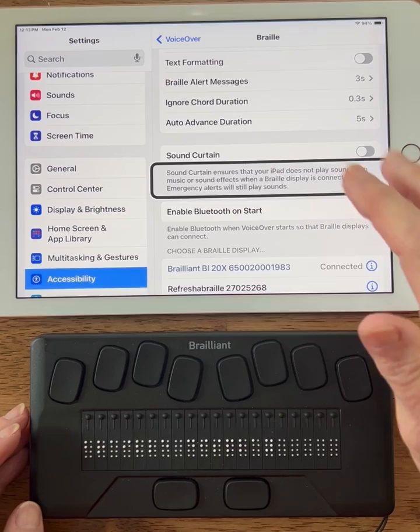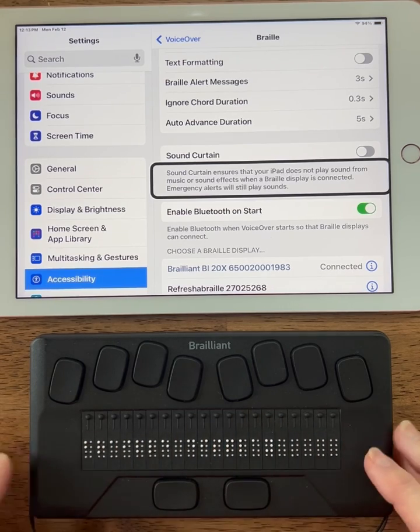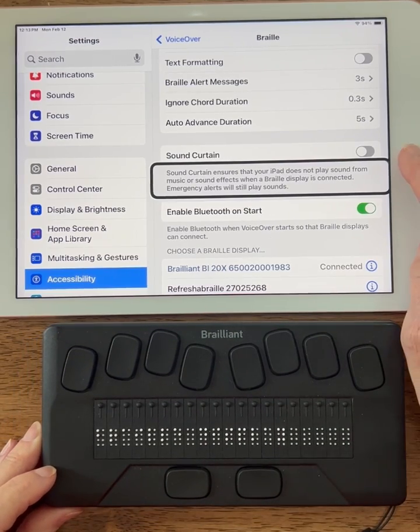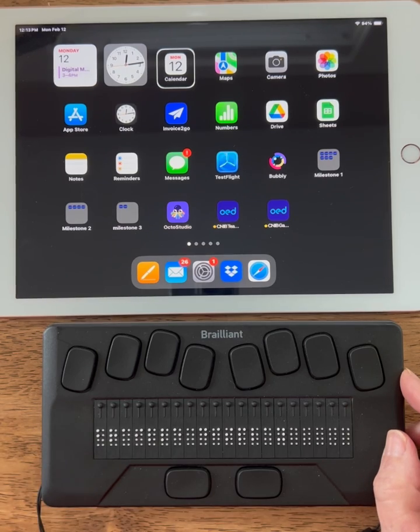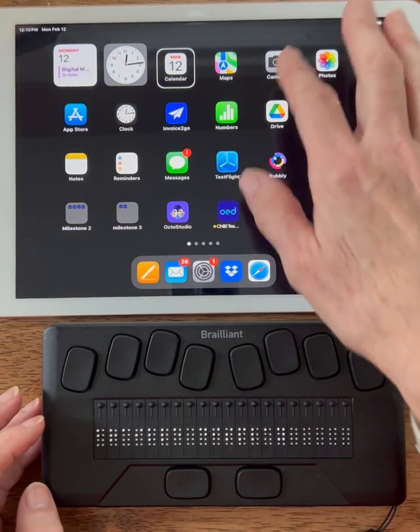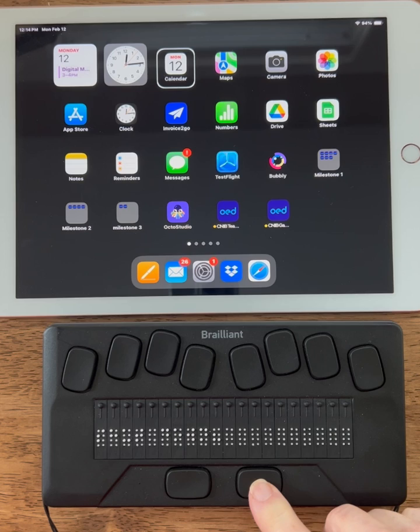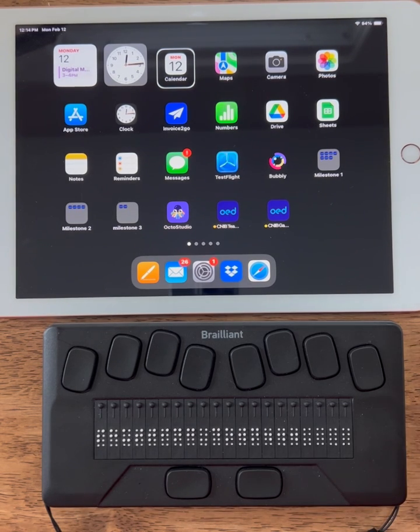I should be able to drag my finger around and the Braille should be mirrored on my Brailliant, but right now it is not. It still says 'Braille display.' Normally if I press my right panning key that will complete the pairing process, but this time it did not change — I've been having that issue where I can't use any of my chords like one-space or four-space to navigate the home screen. Nothing is working. The quick solution is to shut down the iPad. I'm going to use any routing button to select OK and shut it down.